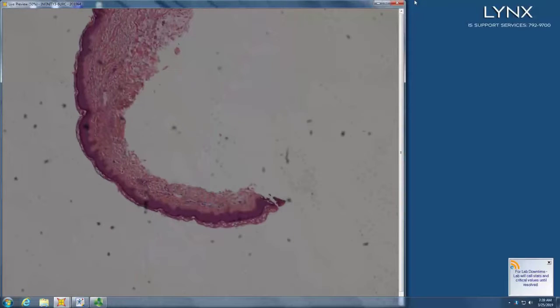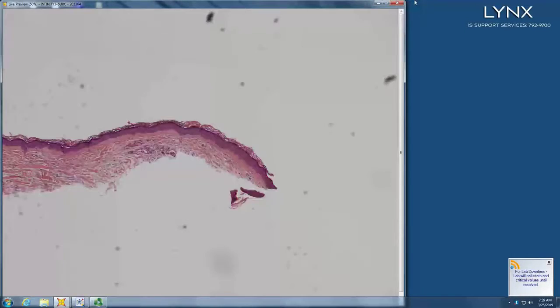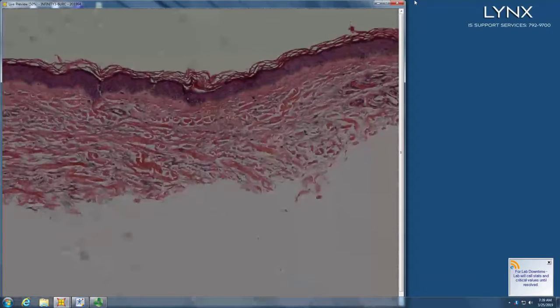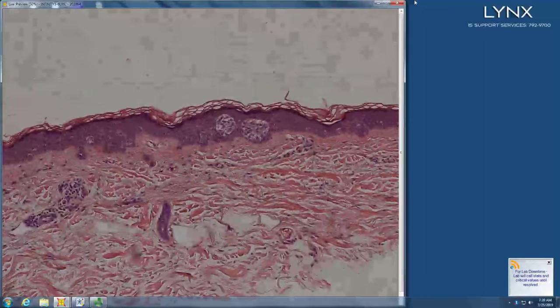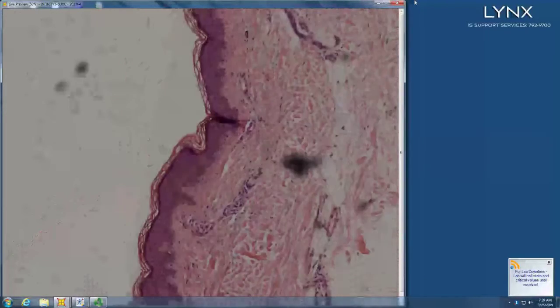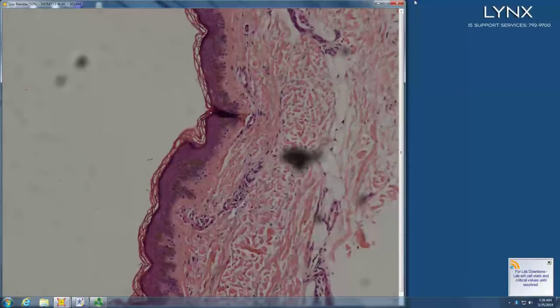Okay, so as a clinician, are you going after small game or big game? Big game. What kind of big game for a big long broad shave? Lentigo maligna or MIS. Those are the two times where we get big, wide shaves. Okay. So which one do you think this is? LM. Right. You've got areas of poorly nested melanocytes, irregularly spaced nests. So, like a malignant.